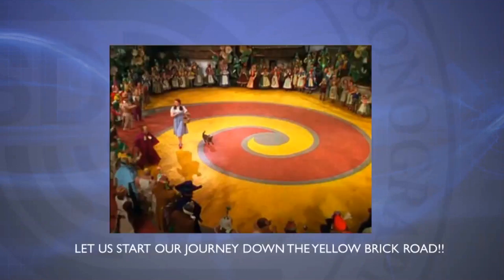So let's start our journey, which may feel like one where we're going down the yellow brick road to get to Oz by the time we get done with this lecture, mainly because there is so much information to go over regarding the foot anatomy, but we'll get through it together.